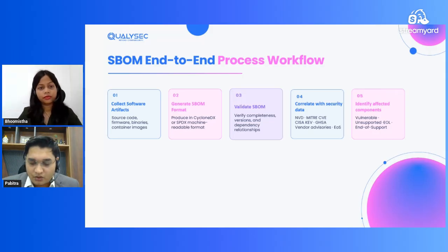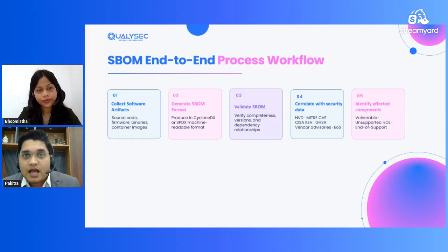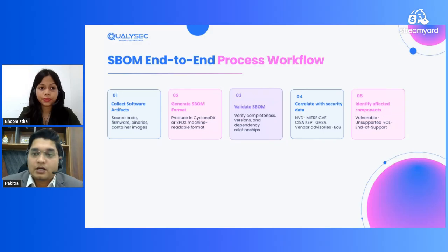For example, a certain version is affected by a CVE, but we have to identify whether that CVE is actually impacting our device or our software or not. We also have to identify the end-of-life and end-of-support status, and mention those things as well.